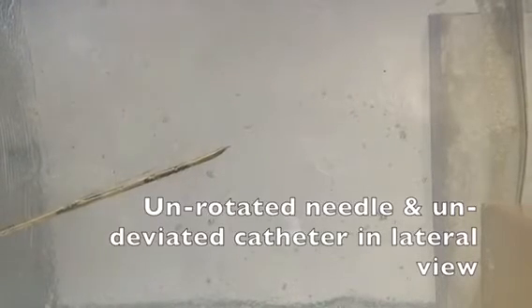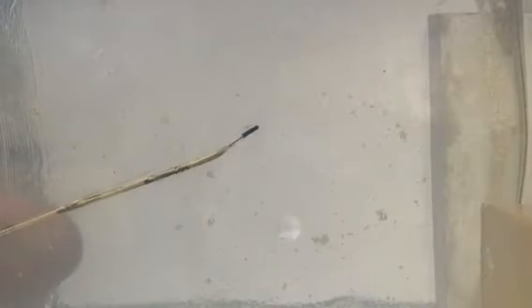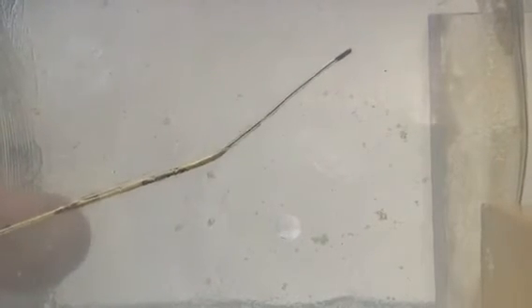Then I thread the catheter into the Tuohy needle here, and thread the catheter until the tip reaches the tip of the needle. And after I identify from the report of the patient, who says, I feel the pressure in the middle of the back, I advance 4 more centimeters of the catheter into the epidural space.